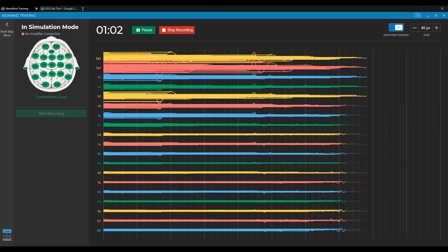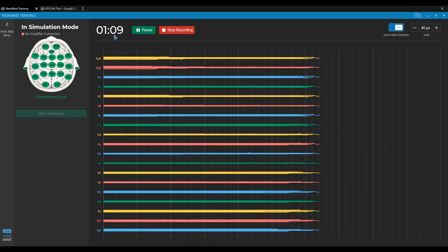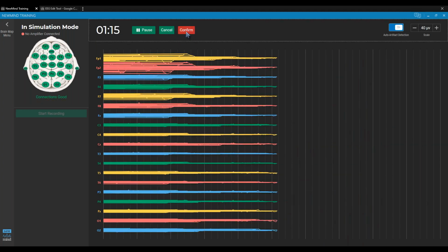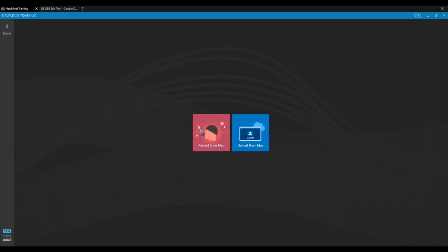That should have been a 5-minute recording if they had a really relaxed client. The response I got from them is it took an hour to acquire the eyes closed and the eyes open, and they commented that it just wasn't conducive in their clinic.